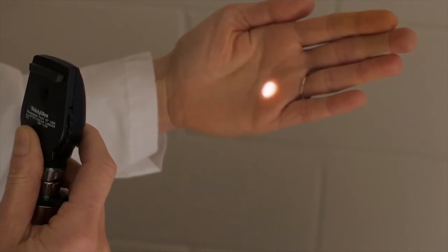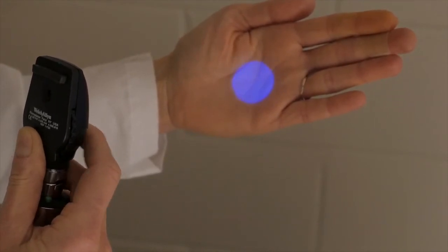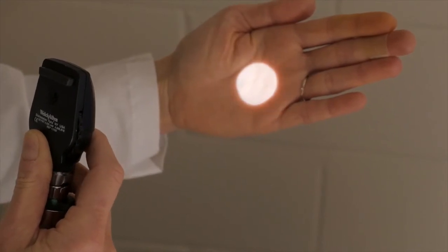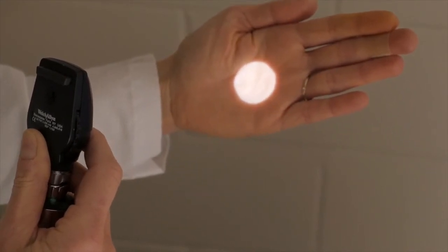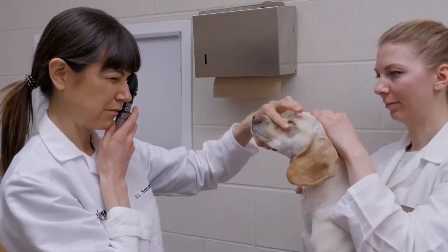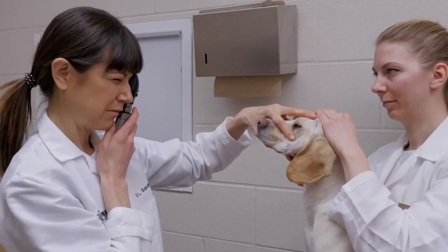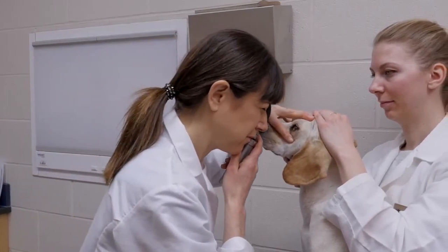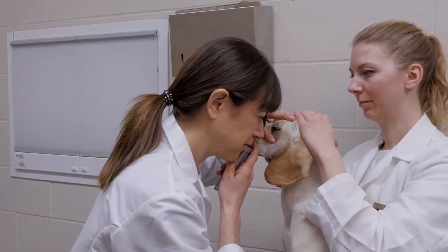For a direct ophthalmoscopy, a darkened room is required and the light source should be set at the largest circle and the diopter setting to 0. The ophthalmoscope is then placed against the examiner's brow while looking through the viewing port at the tapetal reflection. The tapetal reflection is located at a distance of approximately 0.5 meters.